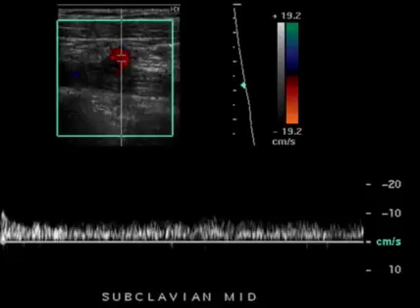If you see collaterals or vessels beyond an obvious thrombosis, again, you will probably lose that nice triphasic waveform. Here you can see we have a collateral dumping into the subclavian vein and an absolutely flat, portal vein kind of flow without the expected pulsatility.